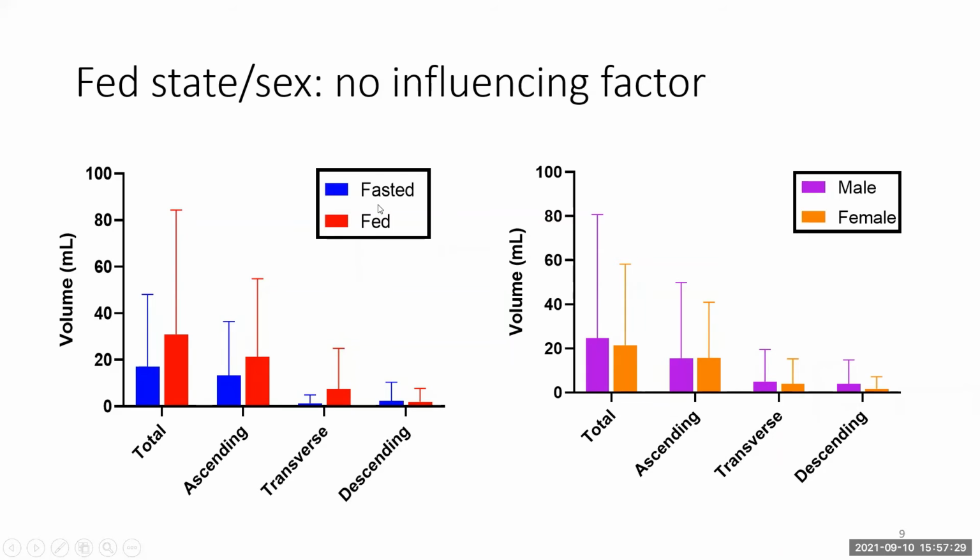You would expect there would be an influence of fat of the 500 ml of Movicol solution they had to take. This solution was only taken 1 hour before the MRI was taken. So maybe it just hasn't reached the colon yet.